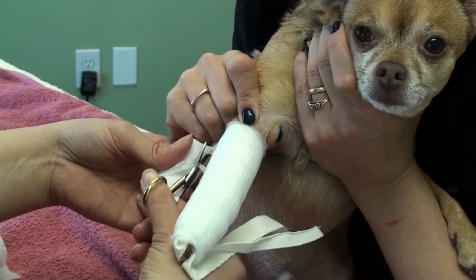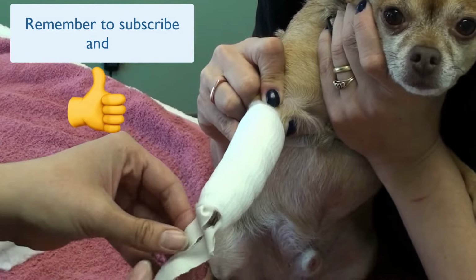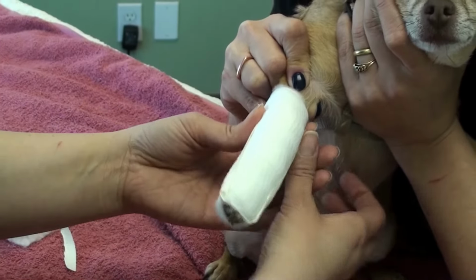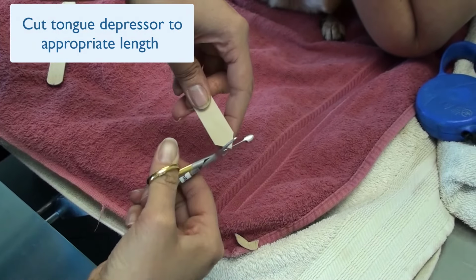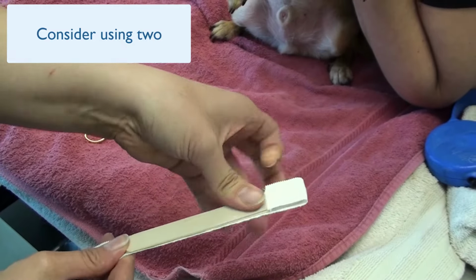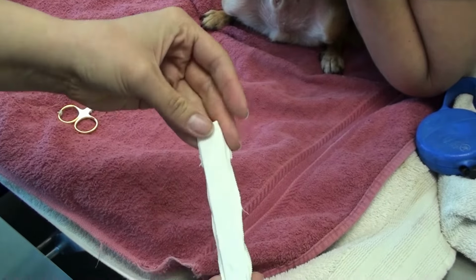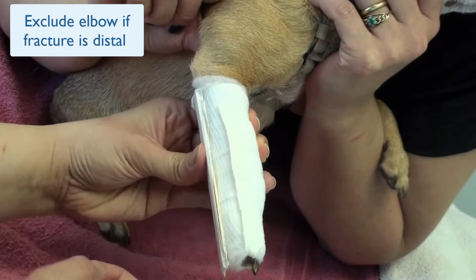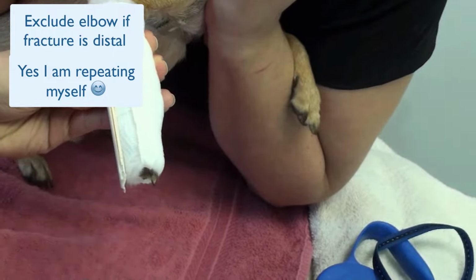The stirrups, which we're going to get trimmed up, are then taped to the cling itself. We're going to cut a tongue depressor to the appropriate length, and in some dogs, a little bit bigger, you may want to use 2 because these are pretty flimsy, and then just tape them together. Because this is a fracture in the distal radius ulna, we can apply the splint below the elbow, so we're not going to immobilize the elbow. And we'll take it all the way down to the toes.